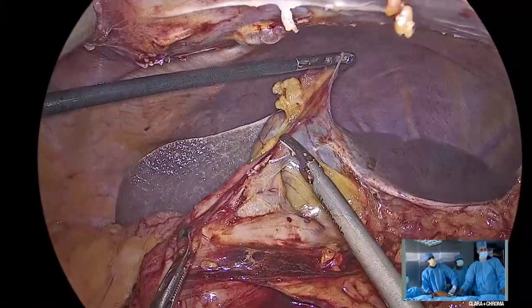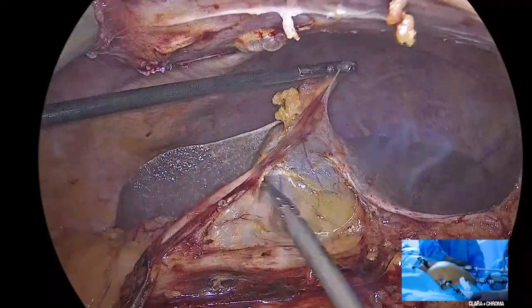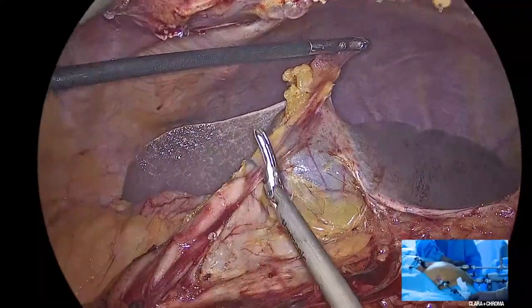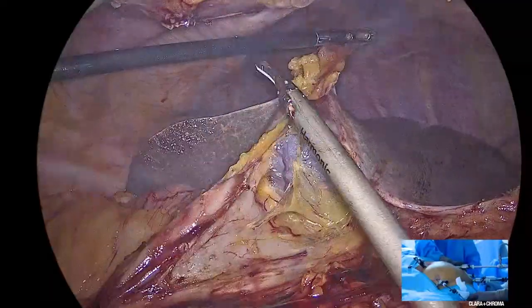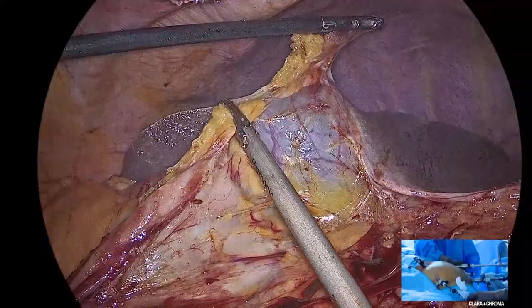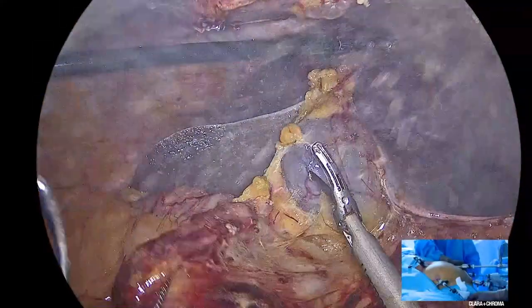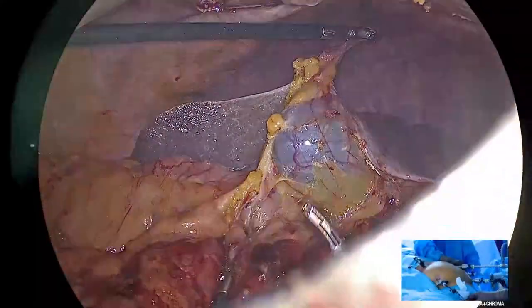This is the hepatic flexure stuck to the gallbladder, which we are trying to release. Wonderful. That requires really a lot of patience. You're doing an excellent job, Jameel. Thank you. And keeping the oozing to the minimum is a great tip that all of us must learn, because oozing here really destroys all the planes.